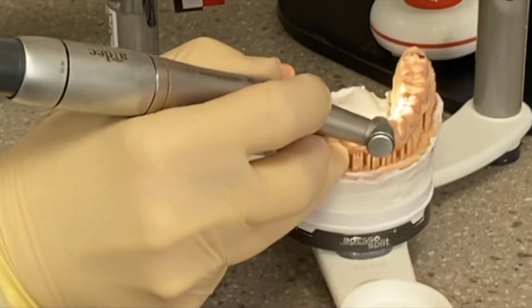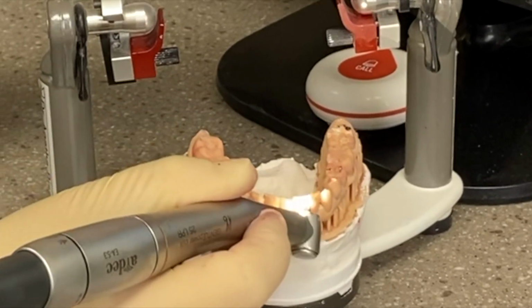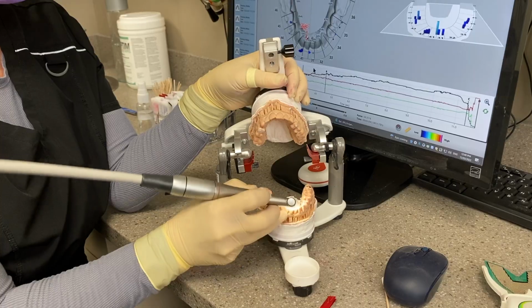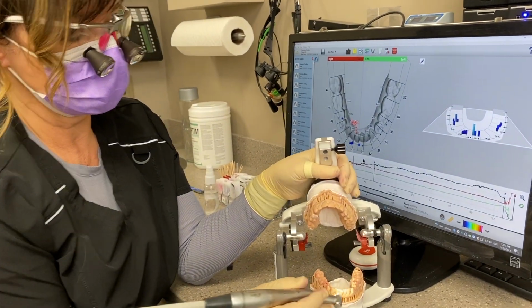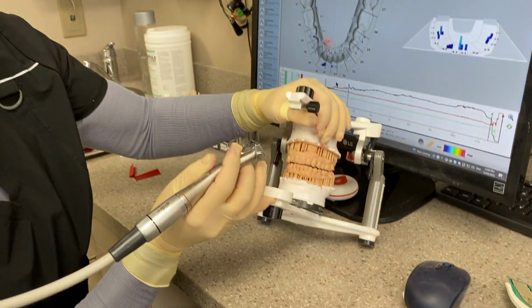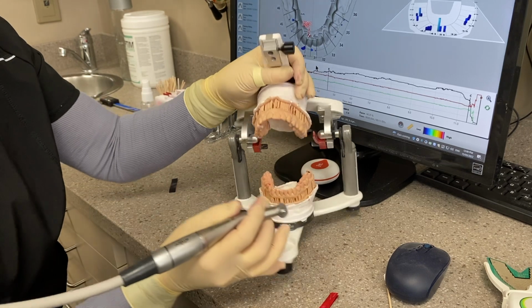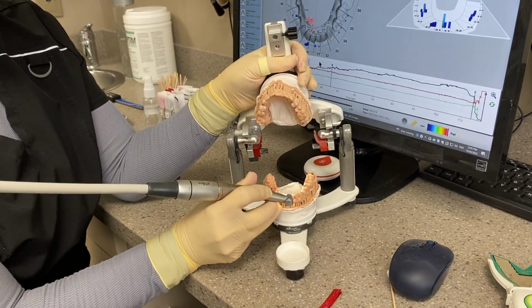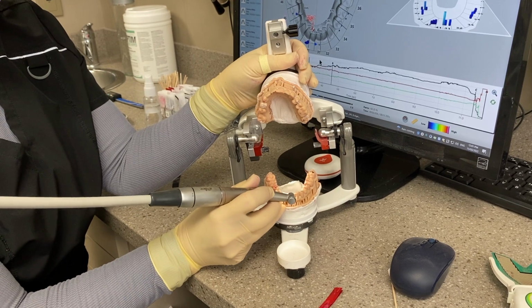Most people actually don't like their lower teeth and want to make them more even. A lot of the times you see chipping and wear and all that. So a lot of the times in equilibration, you actually end up adjusting these guys to better shape than before. So most patients don't mind me grinding the lowers a little bit if I have to.